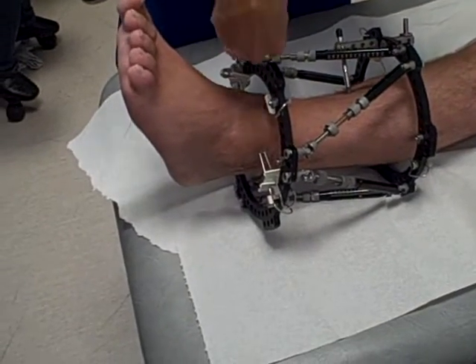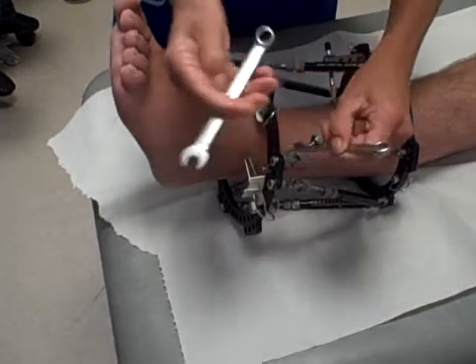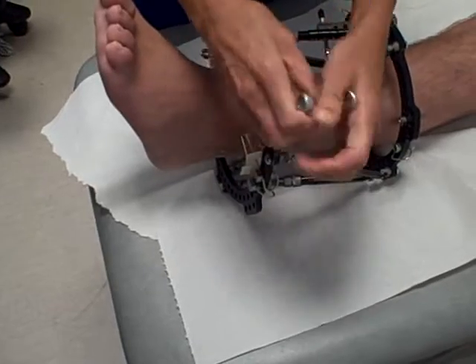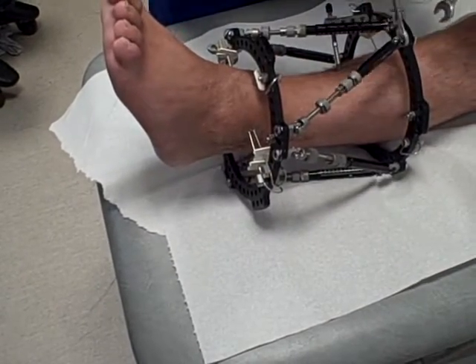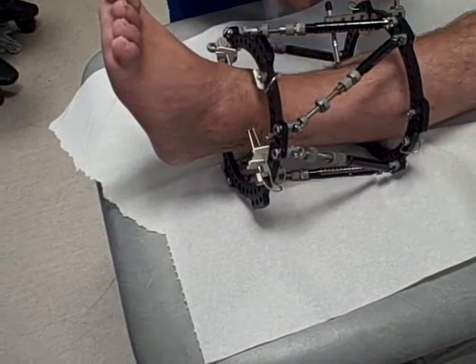We're just going to take all the struts off now. Take them all off and you can have a walk around then, John, and see what it feels like just with the two rings on.